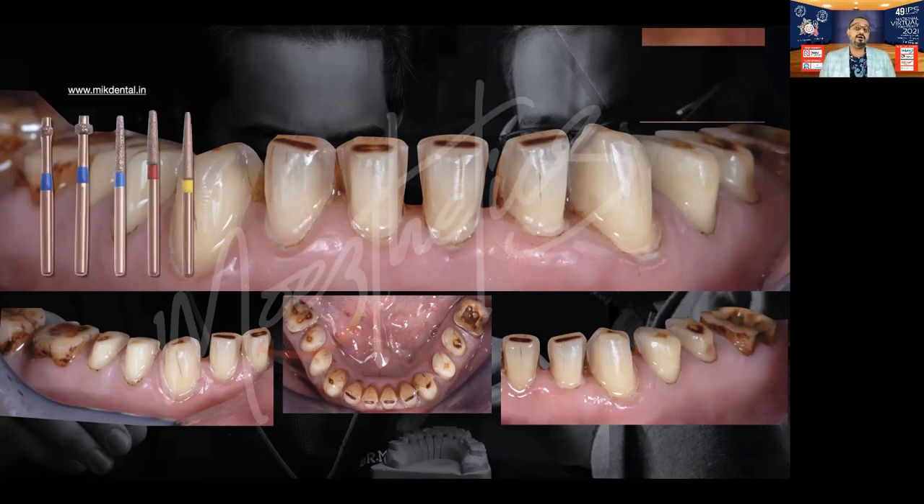These are the set of burrs that I love to use for doing these tabletop preparations — not conventional burrs, but slightly modified burrs. You can find out more about these at mikdental.in. These are burrs that I have designed myself and have patents for, because I believe they make life a lot simpler and more predictable when it comes to getting the preparations the way you want them.